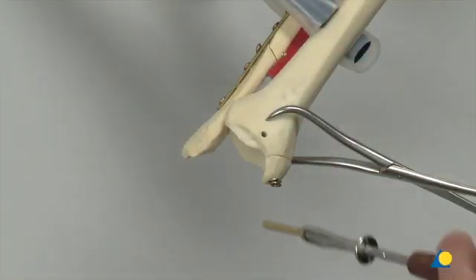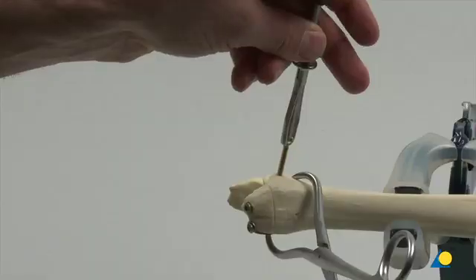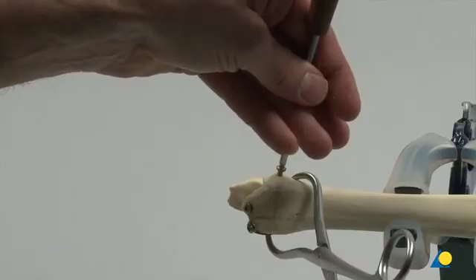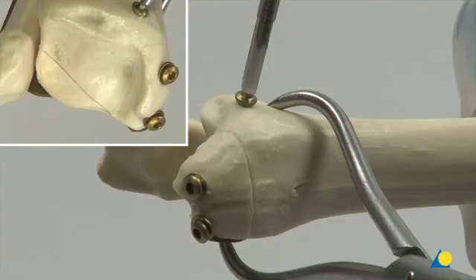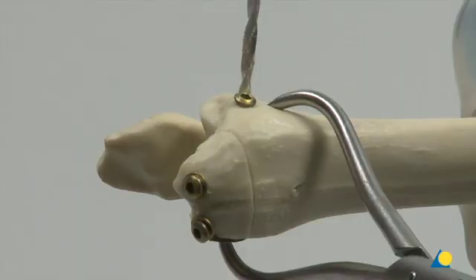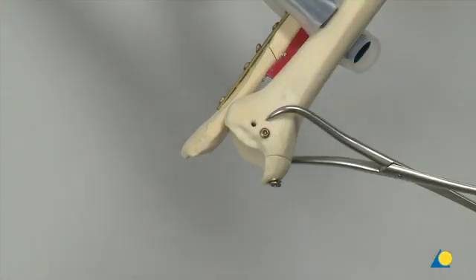The hexagonal screwdriver is used to insert the 3.5 mm self-tapping cortical lag screw. The compression effect is clearly visible at the fracture line. If necessary, a second 3.5 mm self-tapping cortical lag screw can be inserted parallel to the first to protect the fragment from rotation.